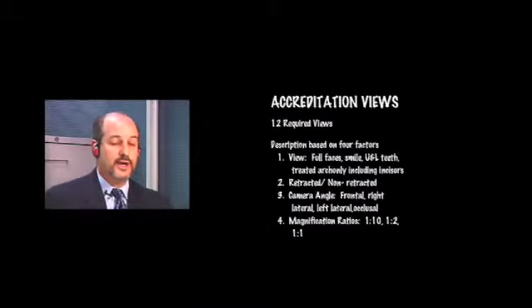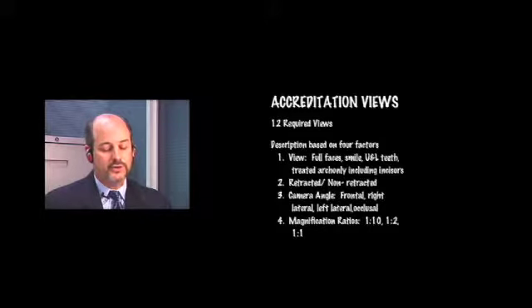For accreditation, one of the objectives I share with you is to be able to take the 12 views. We really start off with a full face view. Then we do the 1 to 2, center, right and left, smiling, and then a 1 to 2 retracted, center, right and left, and then a 1 to 1 view, center, right and left. Those are magnification ratios. The full face is at 1 to 10. Then we go to the occlusal views, which are shot at 1 to 2 also. That's how it comes up with the 12 views.